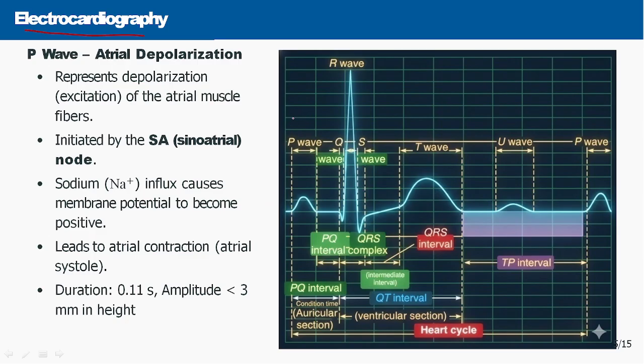This wave has different peaks and different valleys. You can mark here in this graph, we can clearly see that there is one peak here, it is your P wave. This peak is called the P wave and it represents the atrial depolarization. That means when the excitation started at this SA node, first it will depolarize the atria, because as we have discussed, the SA node is present at the top of the right atrium. So, it depolarizes the atria.